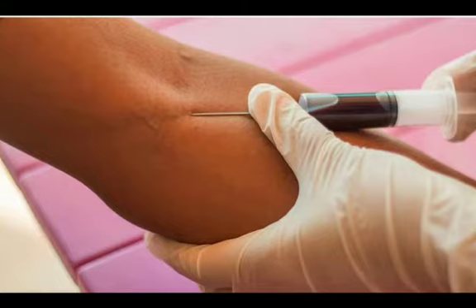When the needle enters the vein, the blood ascends by the capillary feature into the transparent plastic region of the needle, to be sure that the needle is inside the vein. At this point, do not push the needle, and ask the patient to open the fist. Remove the tourniquet and pull the piston. When you pull the piston, the fist must be opened and the tourniquet must be removed. Number 9, remove the needle from the patient's arm and place gauze immediately on the puncture site.